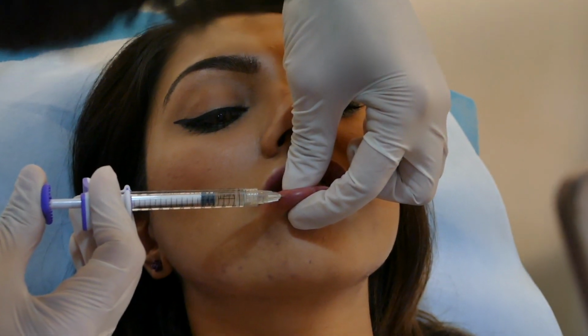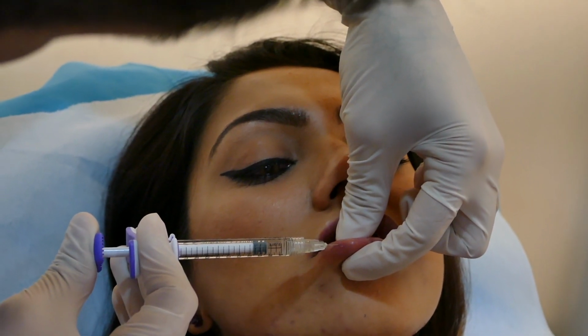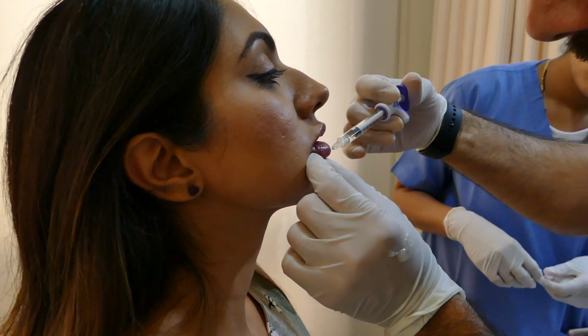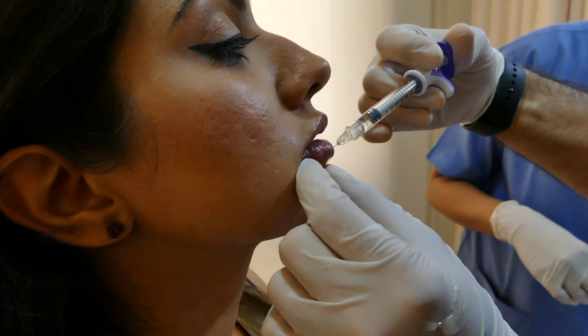After injecting the lower lip on both the sides, make the patient sit up again to assess, and then you can finally tweak by injecting at different places to make sure it is as symmetrical as possible.